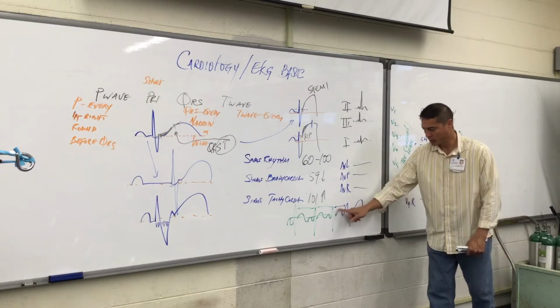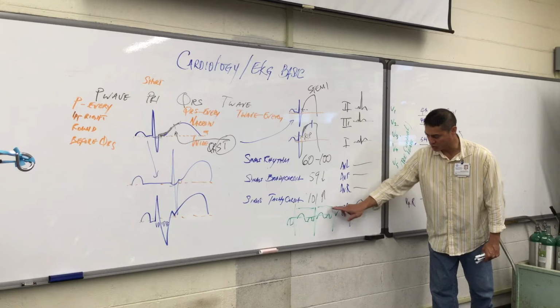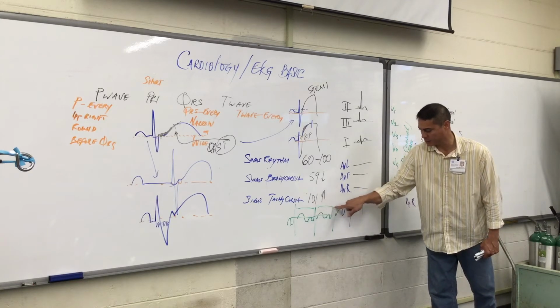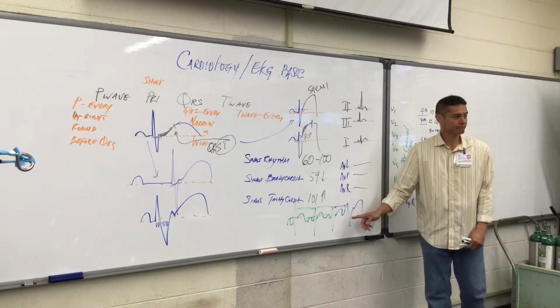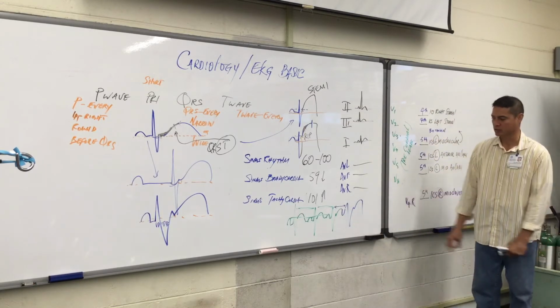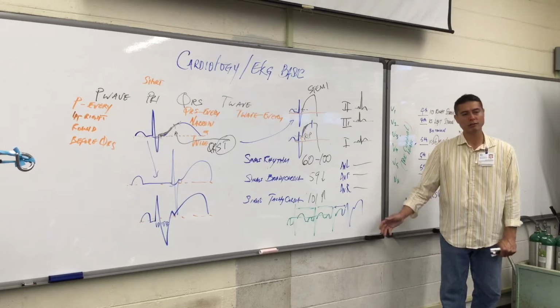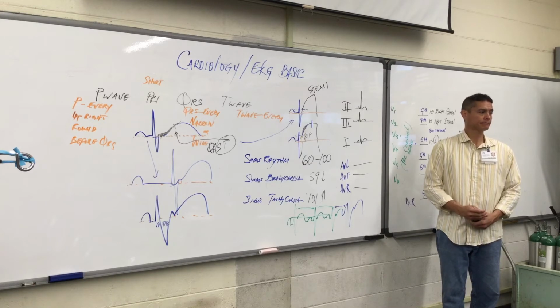And then here we have this blue QRS complex. When you look at the spacing and compare it to these previous ones, the spacing seems too short. It's not as long as it should be. It's drawn in blue here, signifying that it came early. That's what I'm trying to represent, an early beat. An early beat is sometimes called premature.